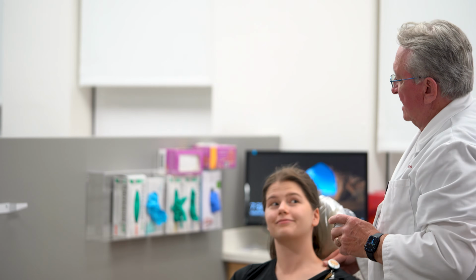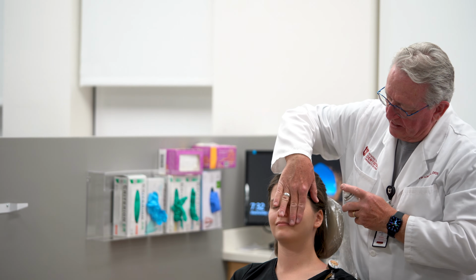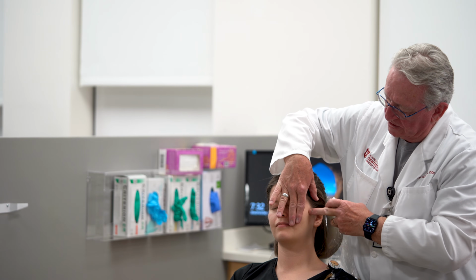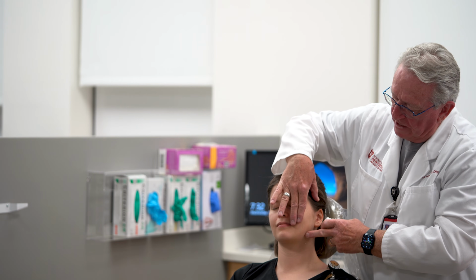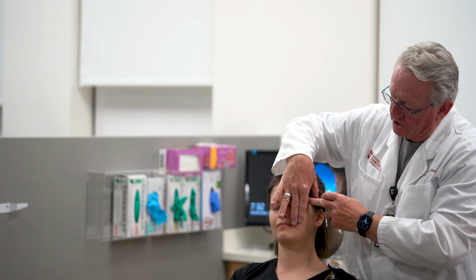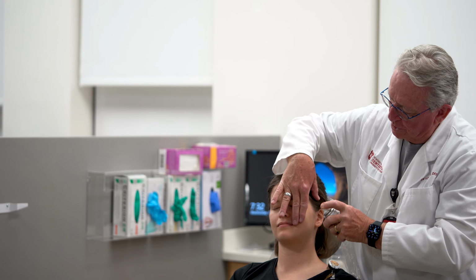Then to go to the facial muscles, you want to cover the eyes, and your spray will start at the temporalis and go down to the masseter and to the border of the mandible, stop, and then come back up and spray down again, and each time do the same procedure so that you're going aligned with the muscle fibers.